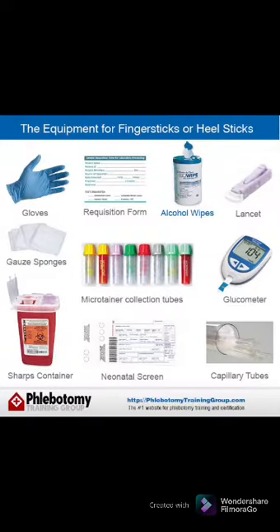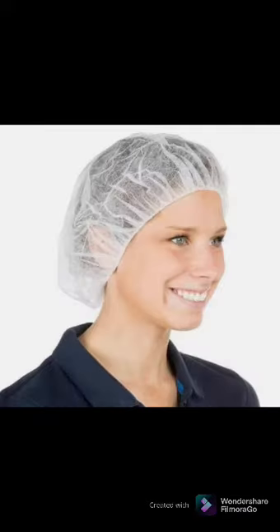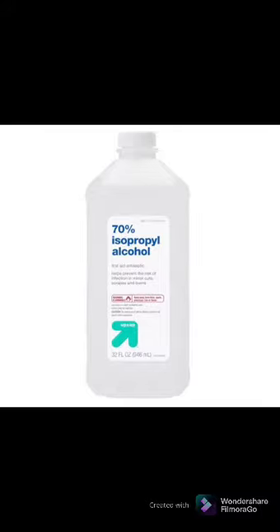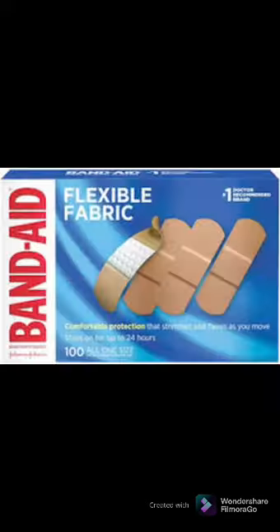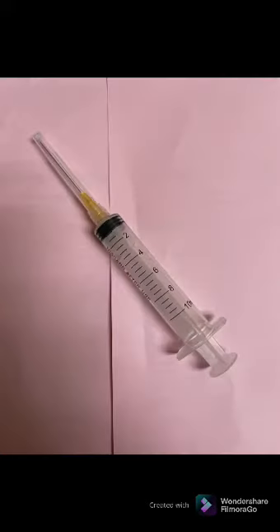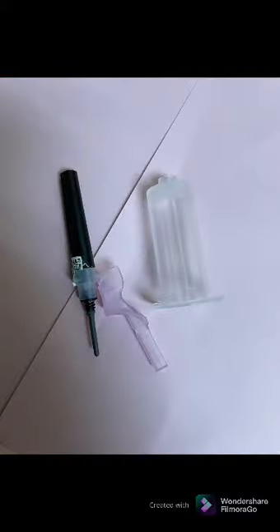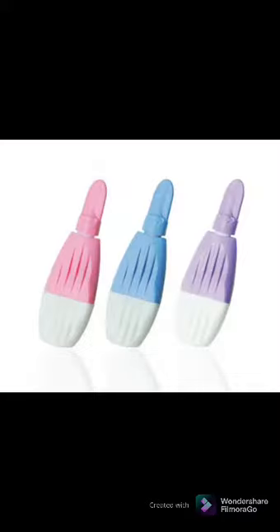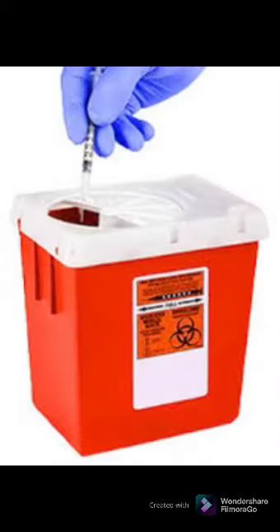Equipment used by a phlebotomist: gloves, masks, gowns or lab coats, hair nets, watches, pens, 70% isopropyl alcohol, gauze, cotton balls, tourniquet, bandages, needles such as the syringe, the butterfly, and the ETS, which is the evacuated tube system, lancets, the vacutainer tubes, biohazard bags and containers, and sharps containers.